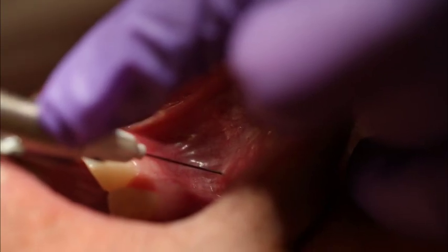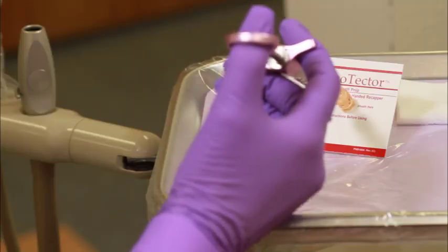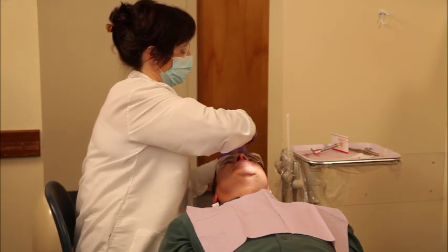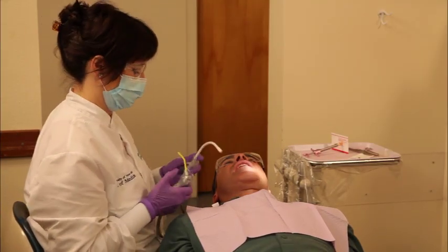Carefully withdraw the syringe and immediately recap the needle using the one-handed scoop method with a needle sheath prop or other recapping device. Rinse the patient's mouth to wash out any anesthetic solution that may have dripped into the mouth. Wait approximately 3 to 5 minutes until anesthesia takes effect before beginning treatment.